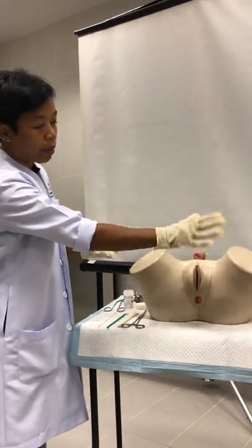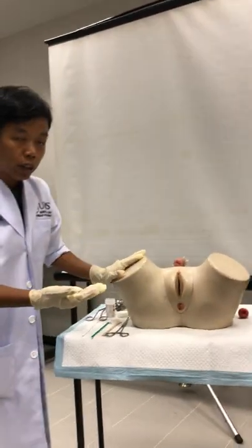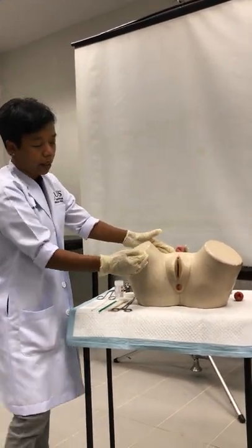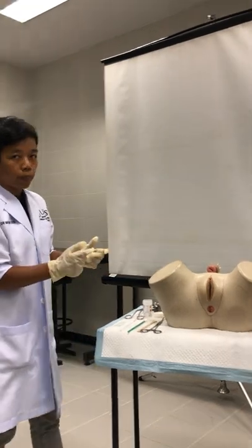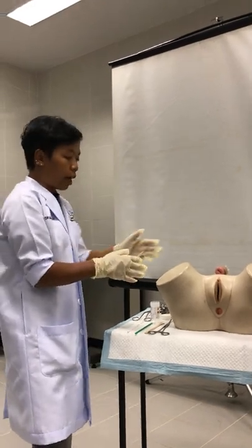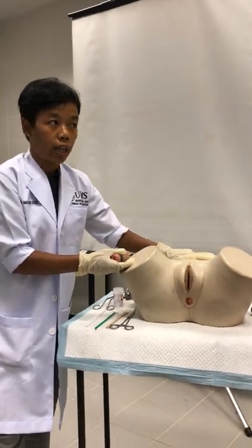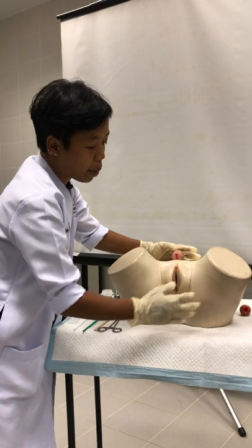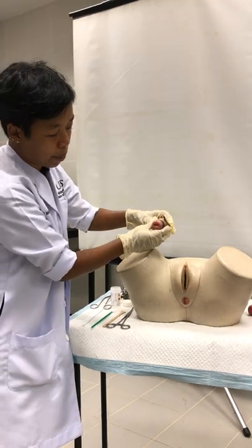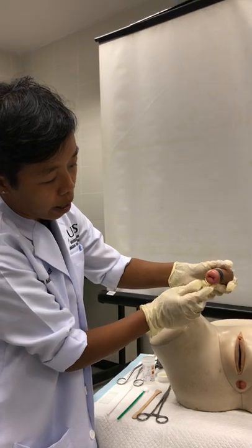The patient should pass urine before she comes for the procedure. She has to be lying down — this is an outpatient procedure done in a clinic. The patient lies on her back in the dorsal position: the two thighs are abducted and the feet rest on the table. If you are doing lithotomy position, the thighs are abducted and placed on stirrups.